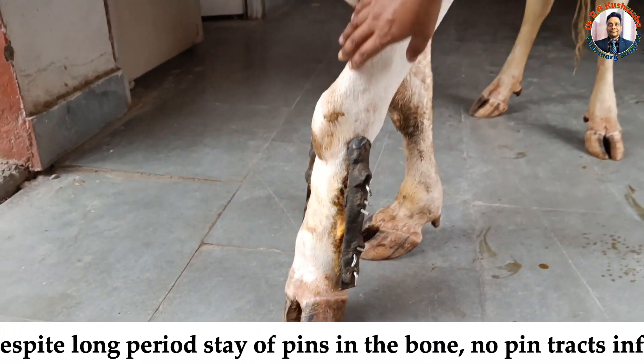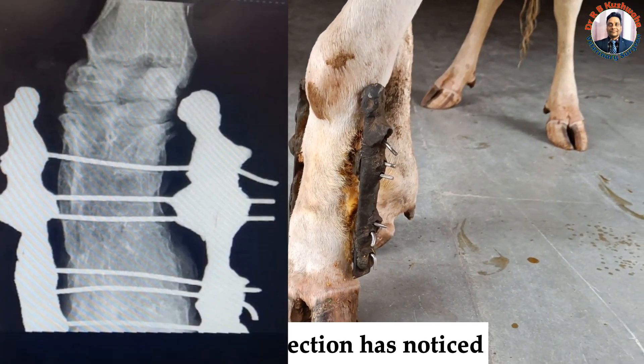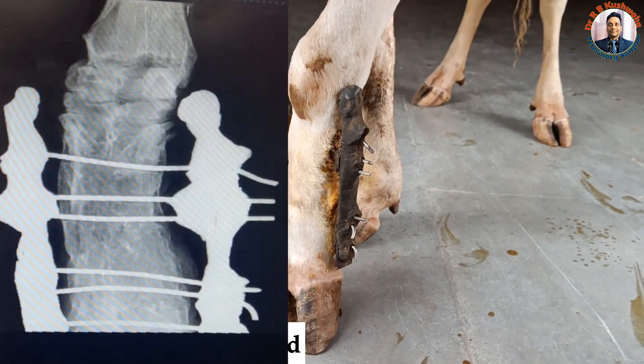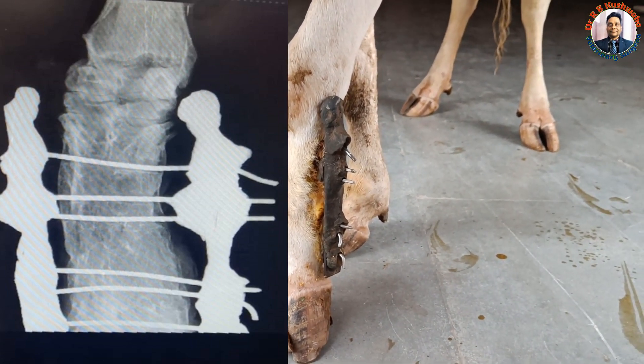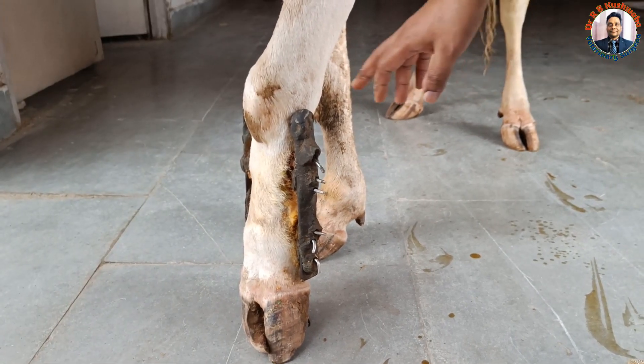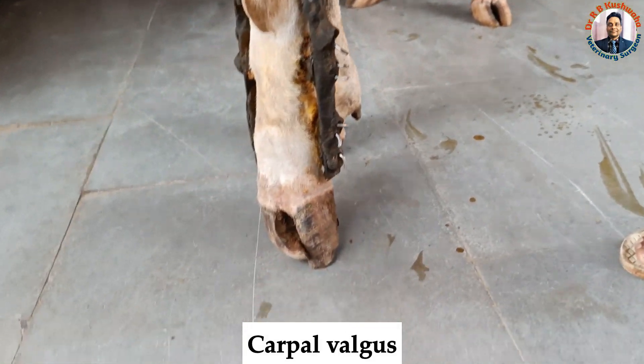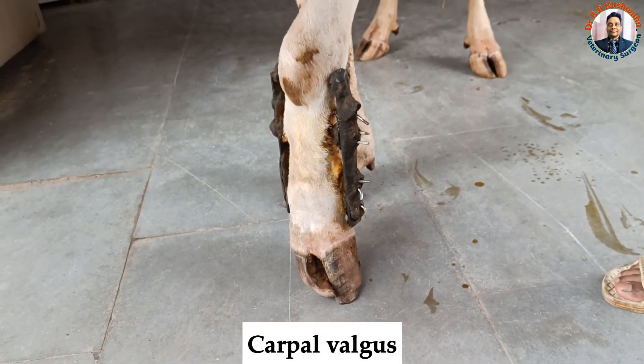You can see there is a swelling in the metacarpal region. We took an X-ray, which revealed union, but there is a loss of the normal anatomy of the metacarpal bone. You can see there is a little outward rotation of the hoof, but the animal is able to walk, as you can see here.